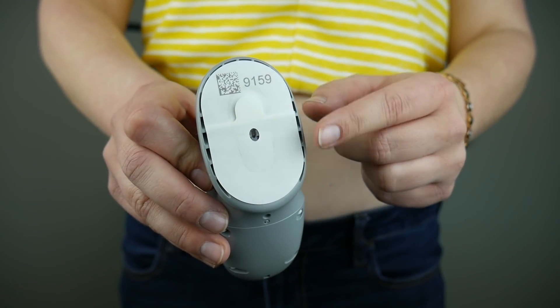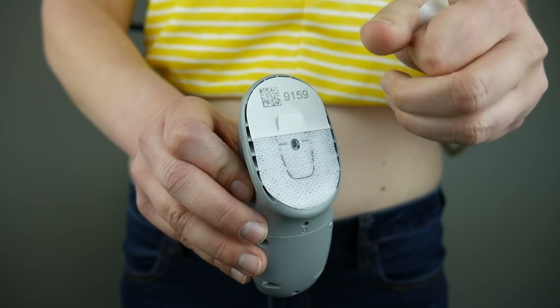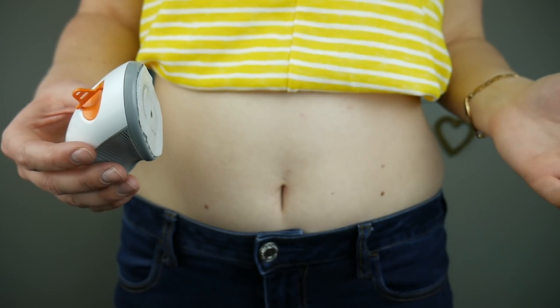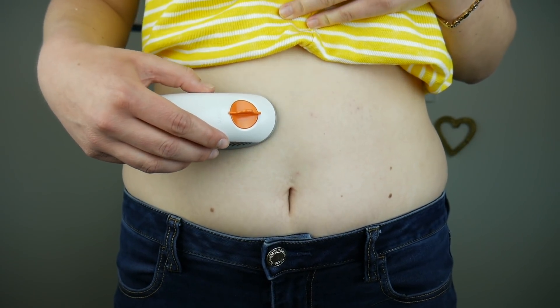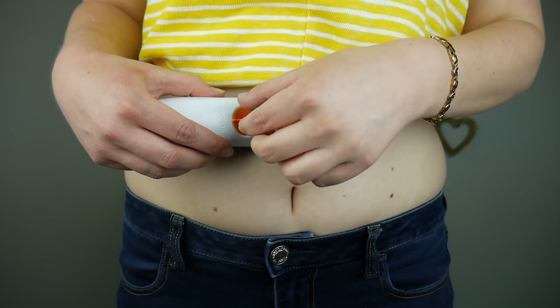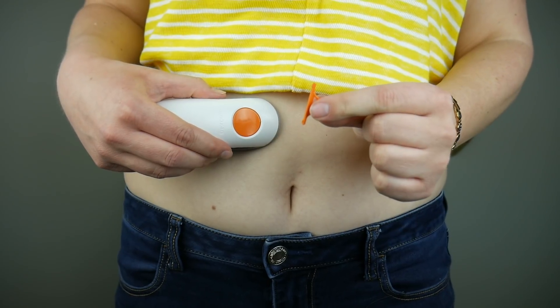Then just remove the adhesive backing — there are two easy pull tabs there. Now I'm just going to stick the adhesive to where I want to insert it, and I'm going to break off the safety latch just by folding it over like that.